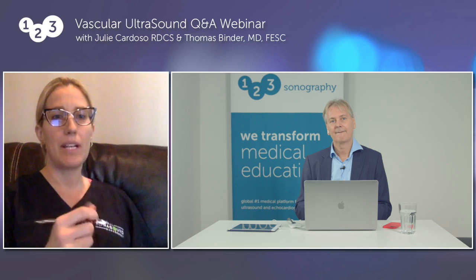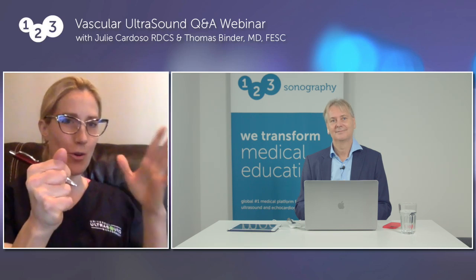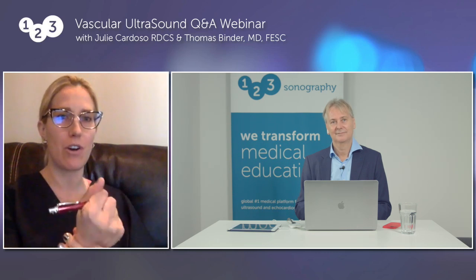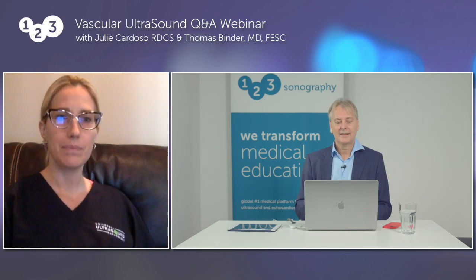And not only that, we all start with the death grip of the transducer because we're so focused on getting the right image, and just over-gripping the transducer alone is causing stress on your wrist. So I'm excited to develop that content with you guys as far as ergonomic positions, for all modalities of ultrasound.